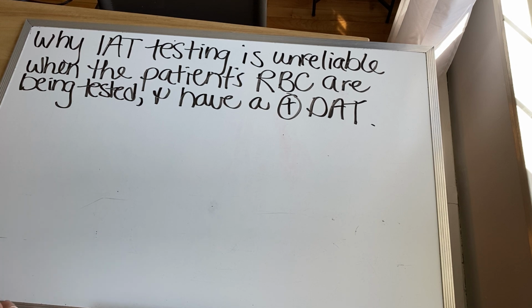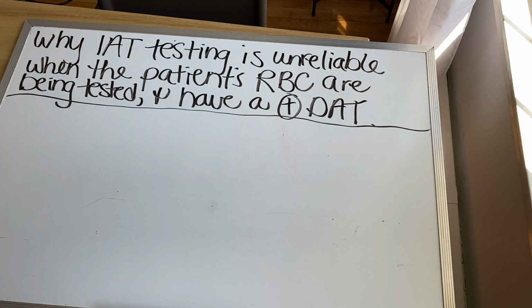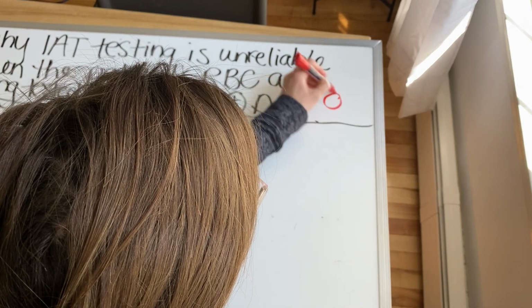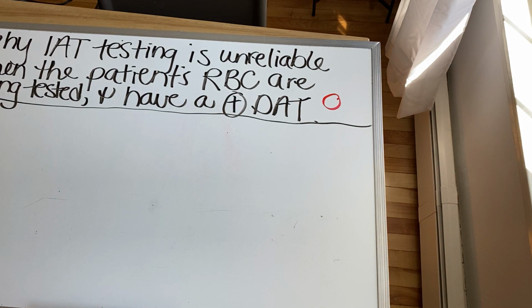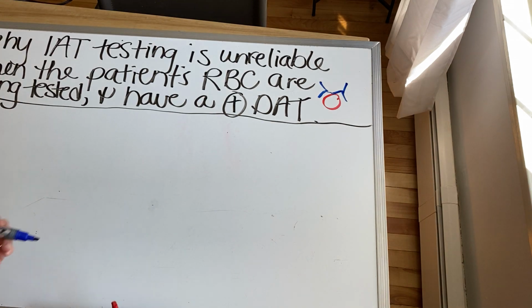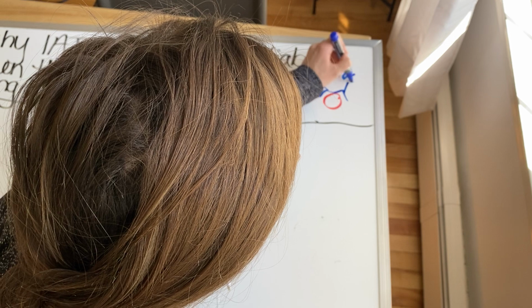So when we talk about a patient having a positive DAT, we are referring to their red cells being previously coated with an antibody in vivo, inside their body.